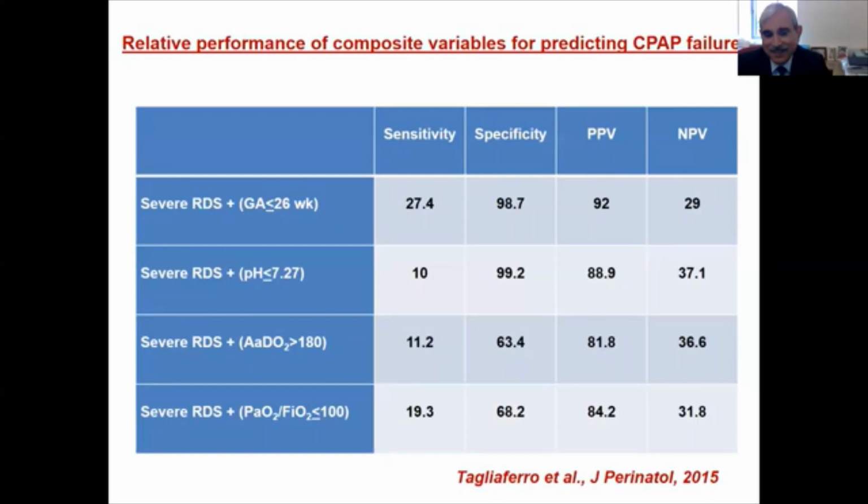It is interesting to note that this new BPD with these new X-ray changes was diagnosed. Now, when I was doing MIST, it's interesting that when you use this 0.3 FiO2 or 0.35 FiO2 cutoff and give surfactant without violating the airway by the LISA technique, the X-ray changes themselves are obliterated. We don't get the classical features of RDS, although if left to its own, following the previous cutoff, intubation and all, you would have got the classical X-ray features.